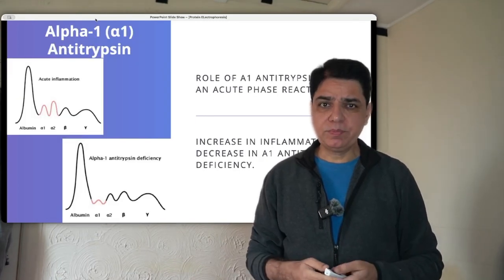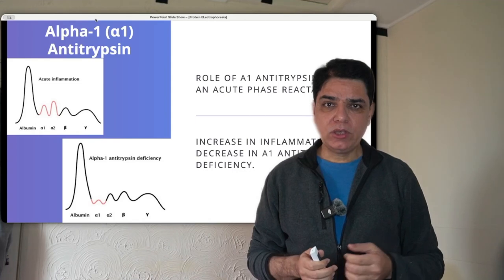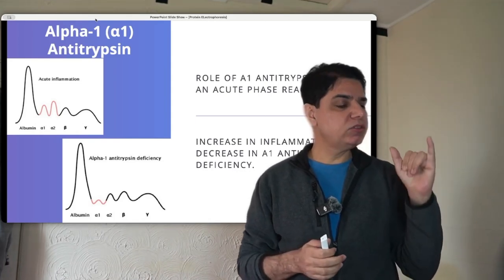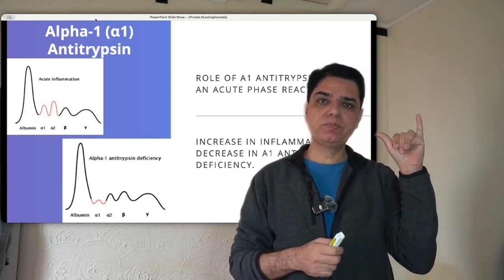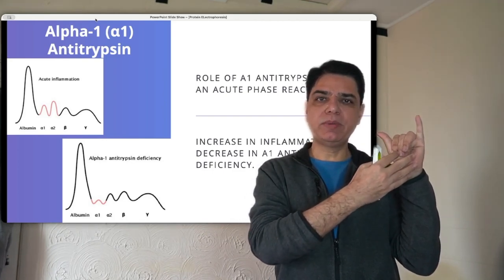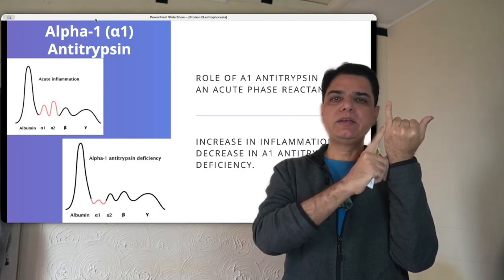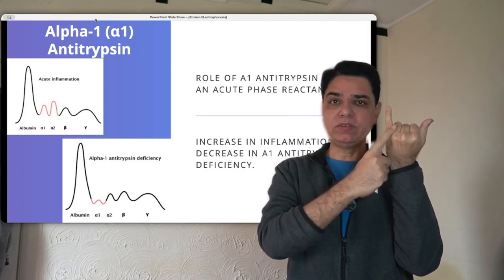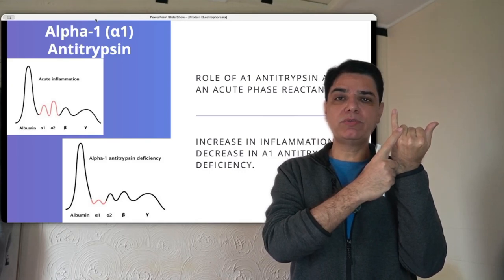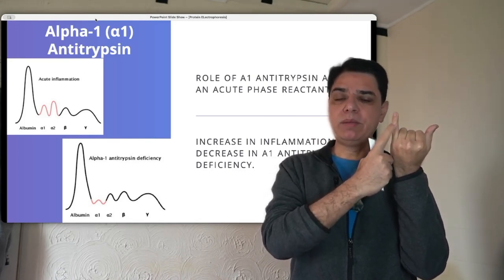Normally, if you look at the protein electrophoresis graph, you would see that it mimics your fist in this peculiar manner. I don't know if it might be showing you the mirror image, but you just have to flip it. So the first spike is your albumin levels. Albumin is one of the major components of your plasma protein, so the first spike is actually your serum albumin levels.